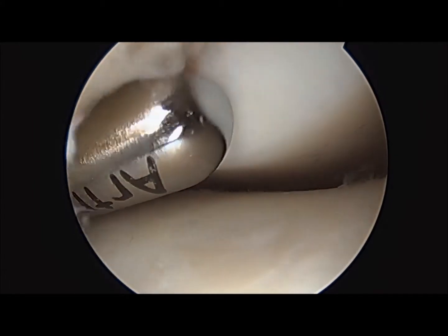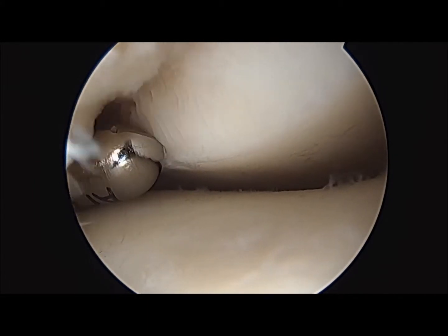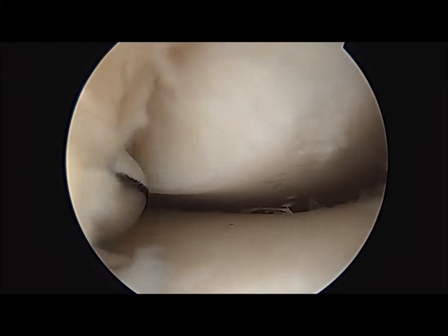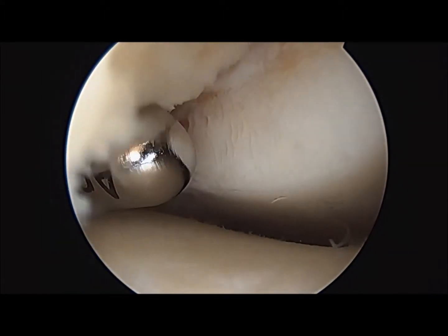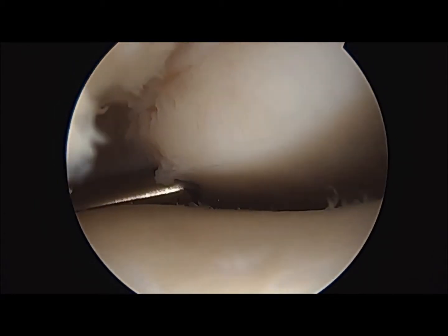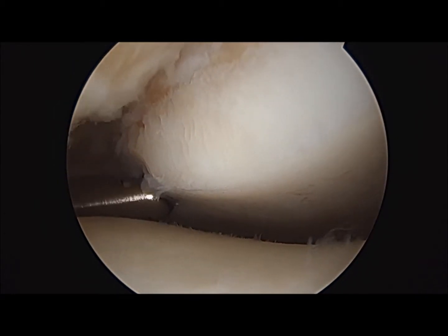Joe, can you pull on the ankle a little bit more for me? Just tug on the line. Tug on the camo line. Yeah, just tug on it. Thank you, Joe, so I can get my instrument in there.